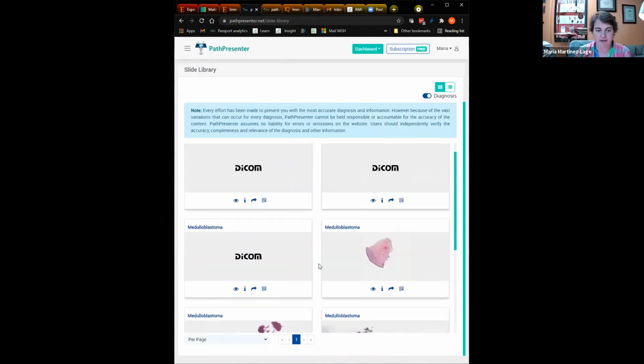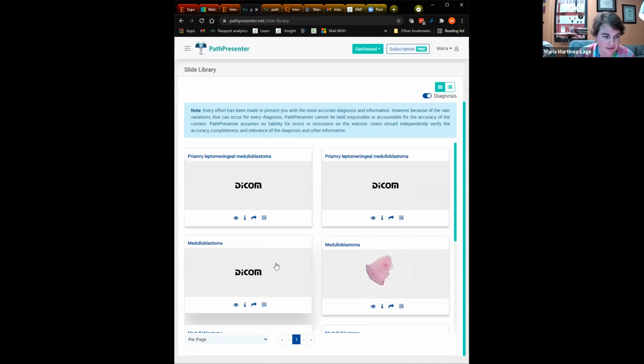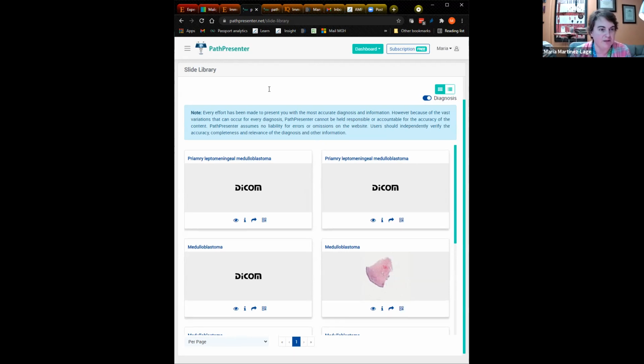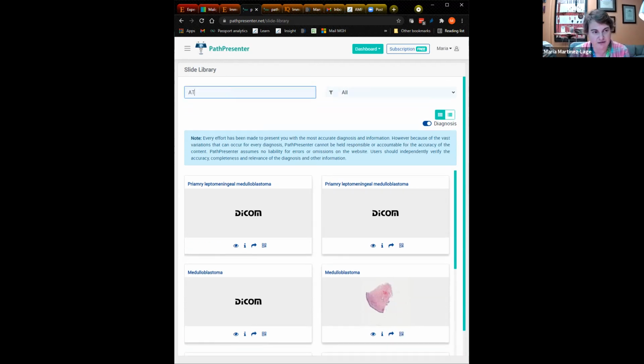All right, and again, the reason that that's important is because the prognosis is going to be different for some of these different groups. For example, the Wnt signaling pathway activated tumors, particularly in older children, have a better prognosis than others. And then in the sonic hedgehog pathway, you actually want to rule out the presence of p53 mutations, because sonic hedgehog activated tumors with p53 mutations have a worse prognosis than those that do not have the p53 mutations. We were talking about ATRT, so let's see if there's one here.